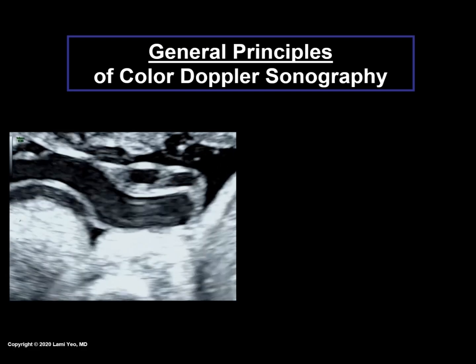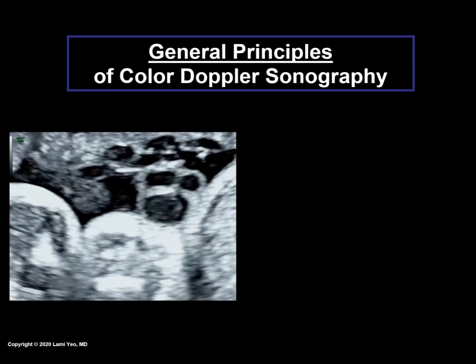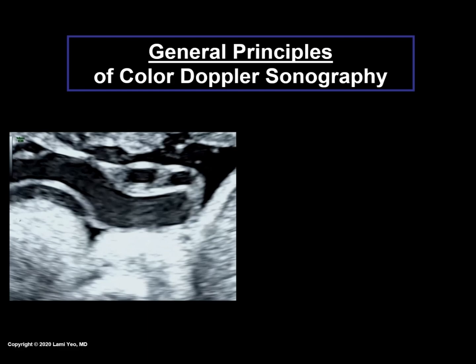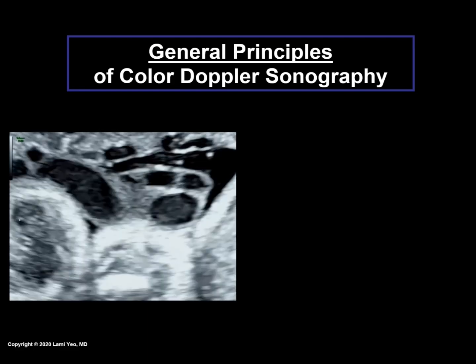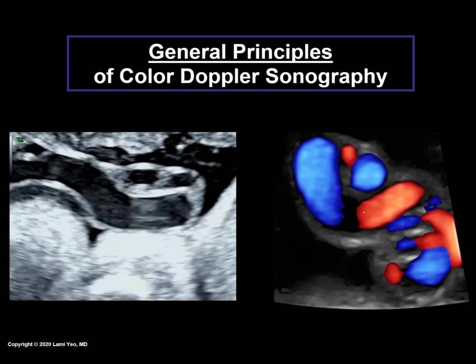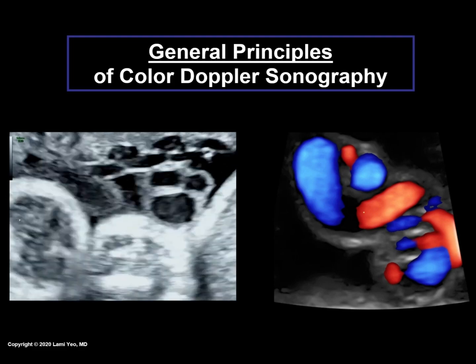This technology detects the frequency shifts of signals arising from blood. For example, the left B-mode image shows blood flowing through the umbilical arteries and vein. The right image is a color-coded map of such Doppler shifts superimposed onto the B-mode ultrasound image.